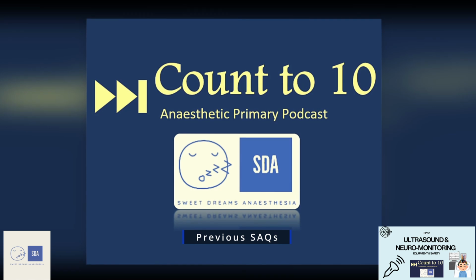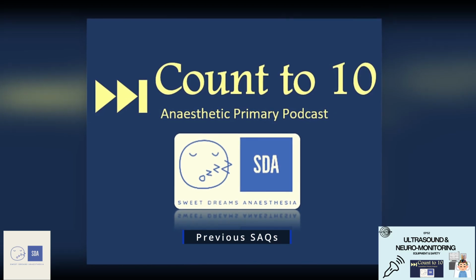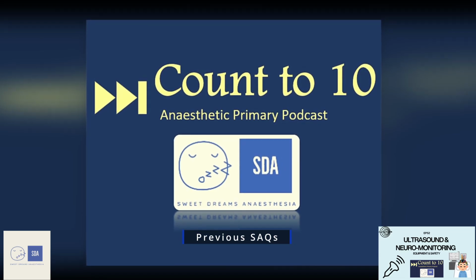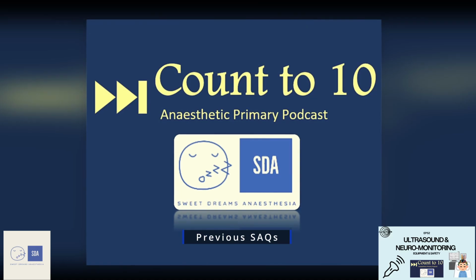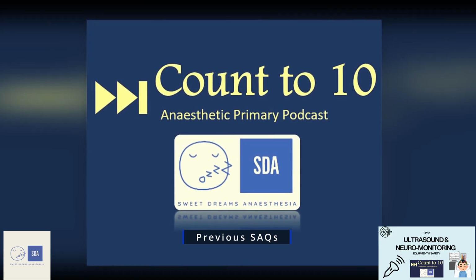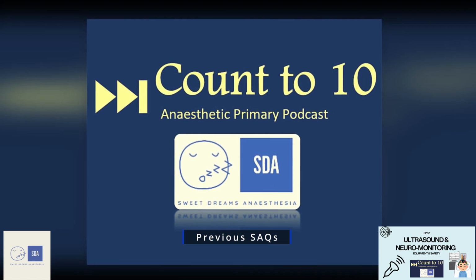Then finally for today, we have the question that was asked in 2023 second sitting, which was: briefly outline the principles of measuring cardiac output using Doppler ultrasound. This had been asked previously, way back in 2005, and this time had a pass rate of 34%. The examiner report mentioned that the key domains were firstly, how velocity is measured using Doppler, and secondly, processing a pulsatile velocity signal to obtain cardiac output.